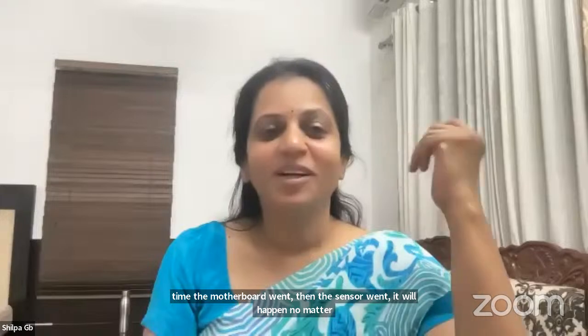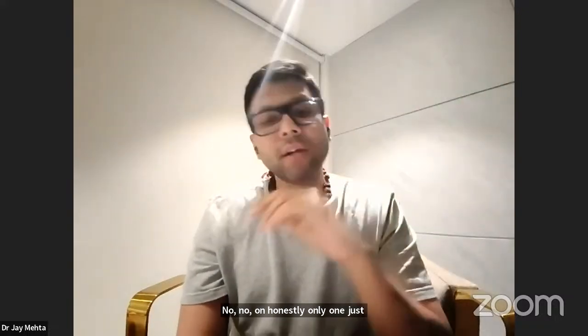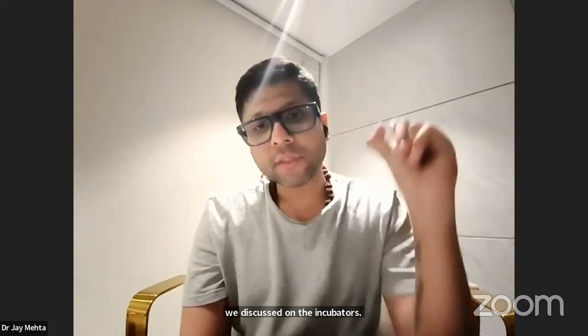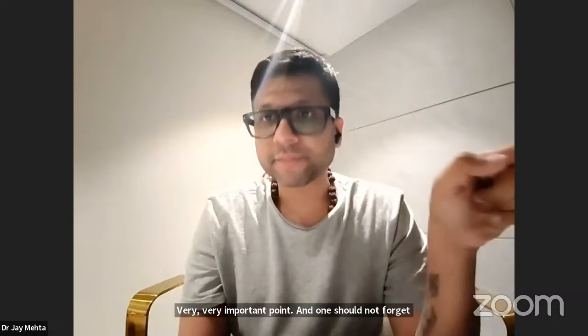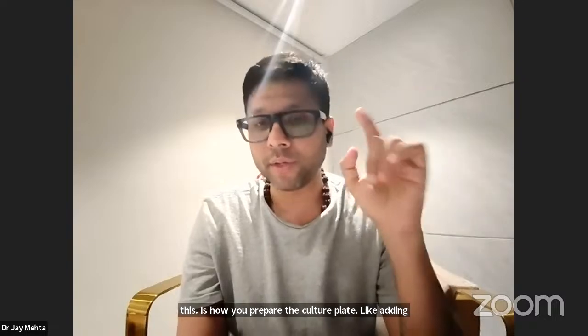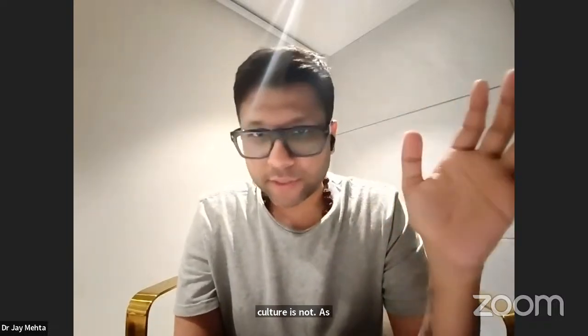I have run out of questions because that's where my limitation of knowledge is. Honestly, one just needs to know this much. I really think, apart from what we discussed on the incubators, a very, very important point, and one should not forget this, is how you prepare the culture plate. Adding oil above the culture media is a very important part to reduce the VOCs from going inside. Open culture is not as great. Closed culture systems are better. There is no question in that.